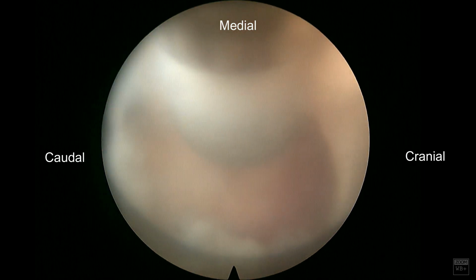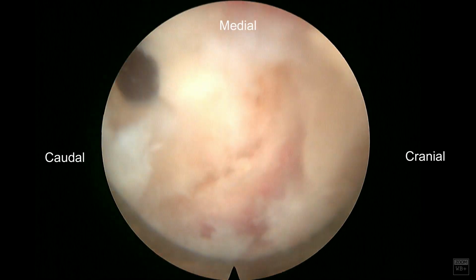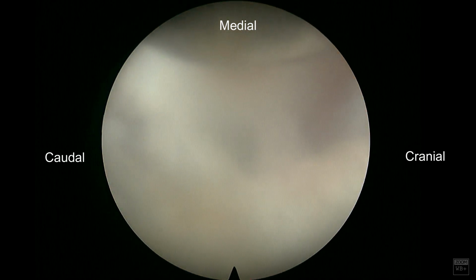I think it's important to not extend the cranial aspect or the cortical decompression too far laterally. So you'll see that I stopped here. It's approximately, I'd say probably about 5 or 6 millimeters.